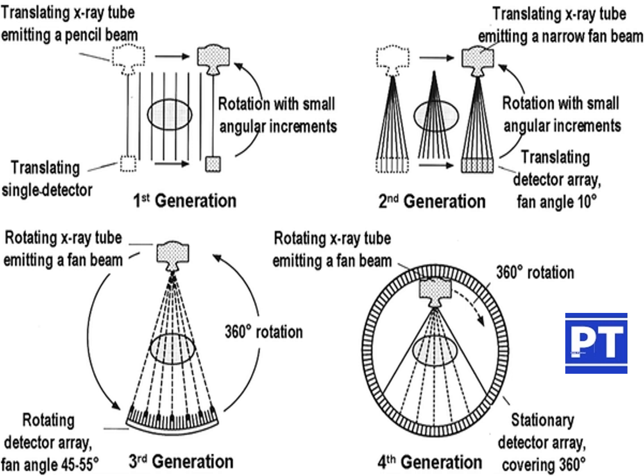Again, moving on to the third generation, you can see the X-ray tube as well as the detectors below and the fan beam. You can see about 700 detectors there, and a 360 degree rotation is shown. You can see the arrow up as well as the arrow down, which means it is moving clockwise as well as anti-clockwise. Continuous rotation is not possible in the case of third generation.